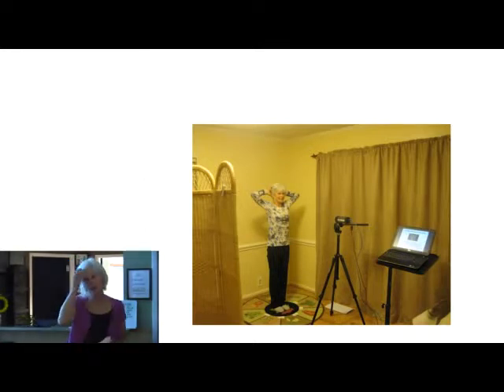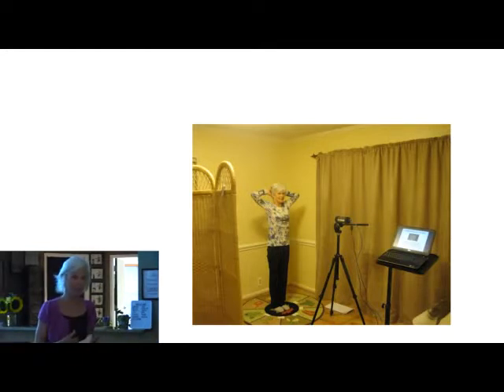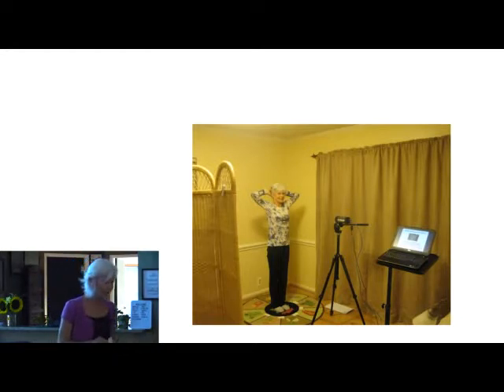That's why good chiropractors are worth their weight in gold, because if they can fix a structural issue, we can see in the images sometimes if it's structure, and the back can tell us that. If there's more heat on one side, and we're seeing the same area showing heat here, we try to be investigative and see if structure is involved. And then a good chiropractor who knows how to correct these structural issues can help you actually improve the congestion in your breast by improving the lymphatic flow, and that's how structure enters into it.